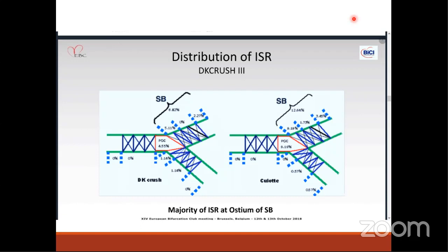What is the polygon of confluence? You draw a straight line at the ostium of the LAD, at the ostium of the LCX, and at the distal left main, and you draw a circle with the central point in between those three. This circle central point is the point of bifurcation, and those three lines touching the margins of the circle is known as the polygon of confluence. Thank you so much, Karim.